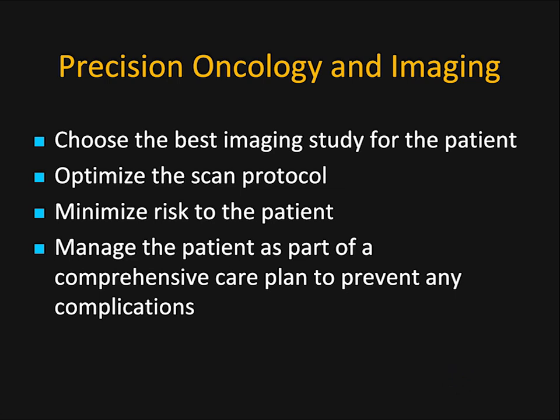Minimize the volume of contrast to the correct amount. Don't give any extra. Pre-warm the contrast. Hydrate the patient, if necessary, pre- and post-study. Minimize the risk to the patient by using isoosmolar agents. And again, I think we need to really be thinking about a comprehensive plan to help prevent or minimize any complications. And with that, I thank you for your attention.